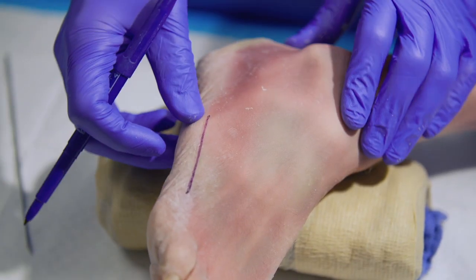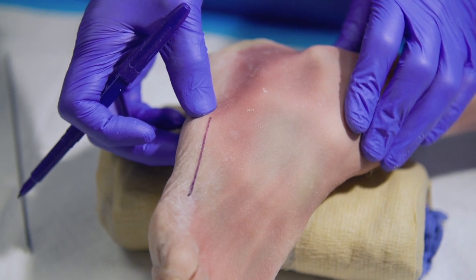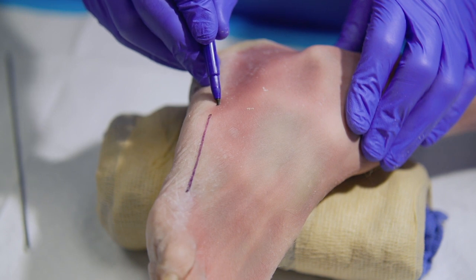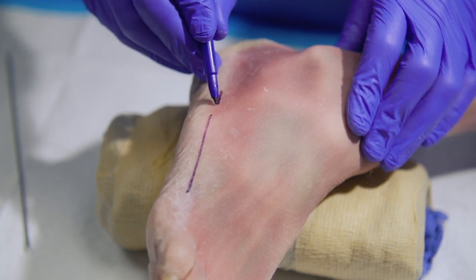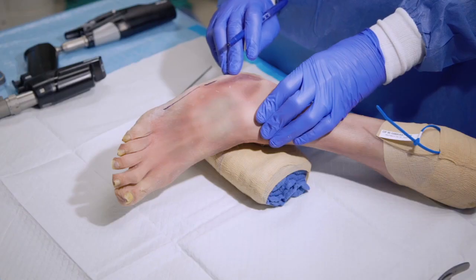One mistake that I see people commonly make is placing the incision too close to the fifth metatarsal cuboid joint. I recommend an incision about one and a half to two centimeters proximal to that insertion point of the peroneus brevis tendon.